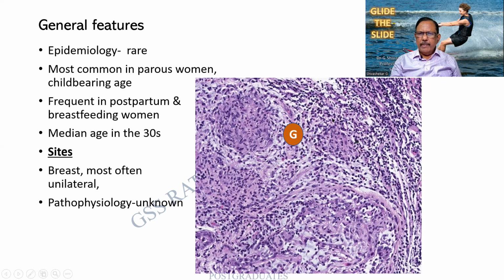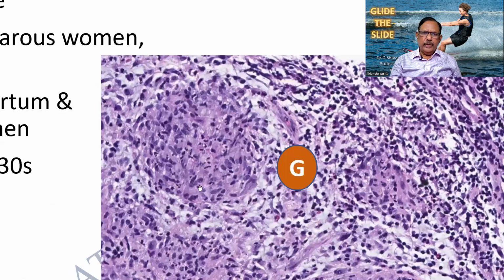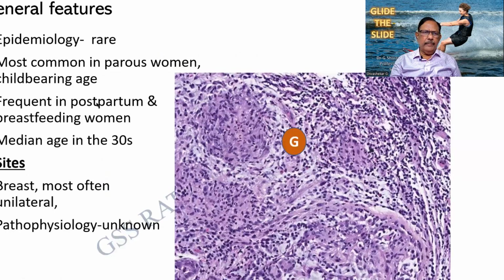Look at this. I am able to find multiple, rather well-defined lesions, which are dark and are composed of large cells, which I can see. Let me go to a higher magnification, if you can see it better. Okay. There are some slipper-shaped nuclei. Probably they are epithelioid cells. Plasma cells are present, and also there are a good number of lymphocytes. And intervening is a loose fibroconnective tissue that I am seeing.